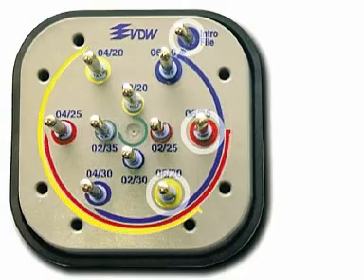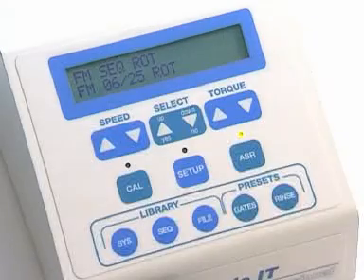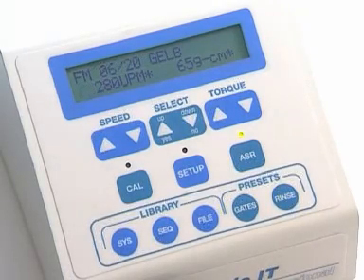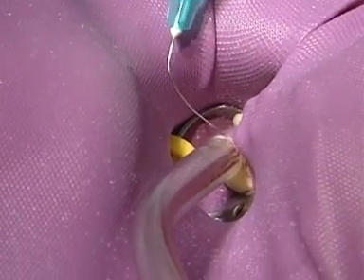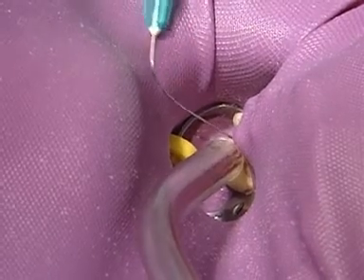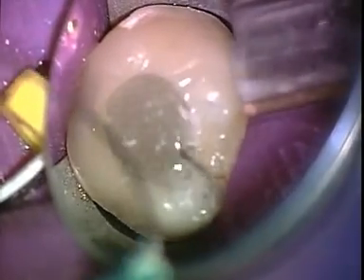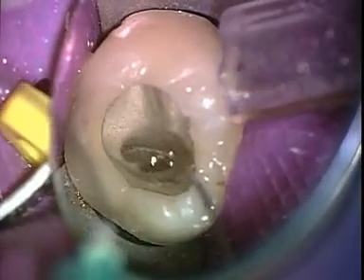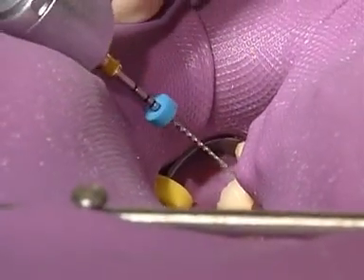The next file in the red sequence is the 0620. It is the second position of the red sequence. The instrument is selected with the down key. It is very important to irrigate frequently. When it comes into contact with sodium hypochlorite, FileCare EDTA reacts with a foaming effect, which leads to pulp tissue and debris being actively flushed out of the root canal.